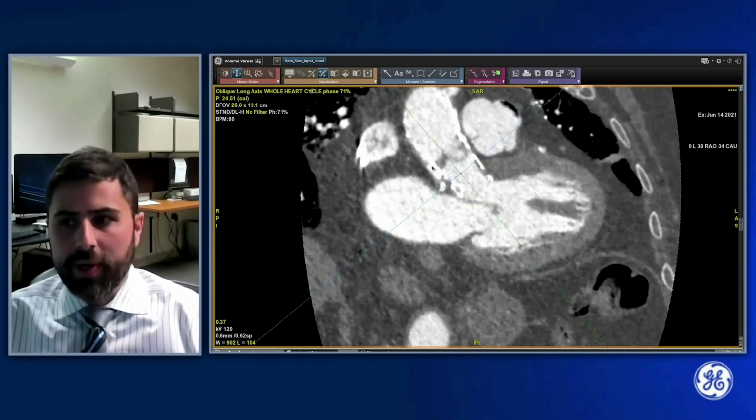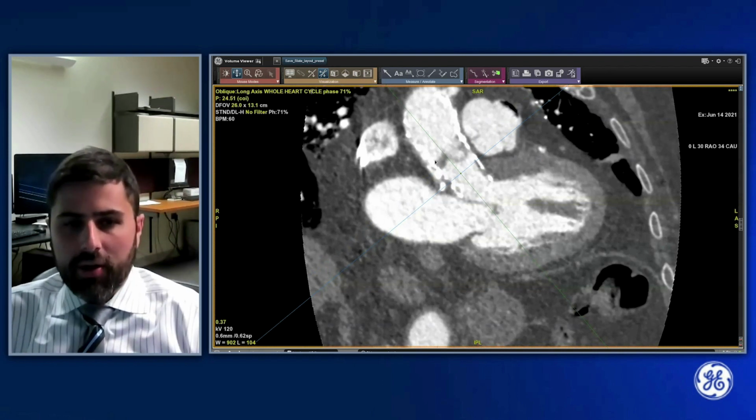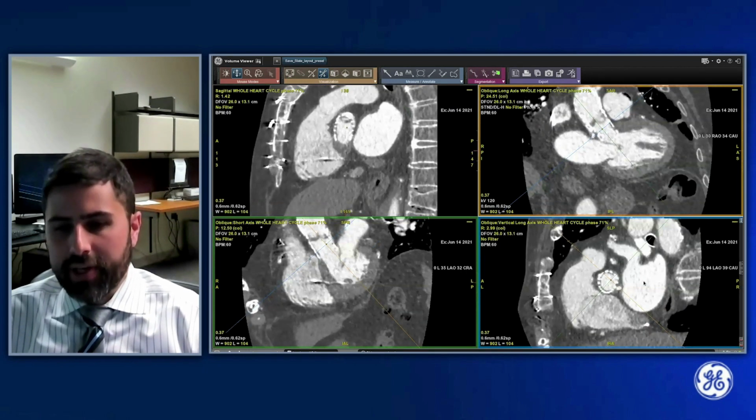which is consistent with hypoattenuated leaflet thickening or HALT, which occurs due to subclinical buildup of thrombus on the valve leaflets following TAVR, which has been fairly well described following this procedure, and is a reasonable cause for gradient elevation.